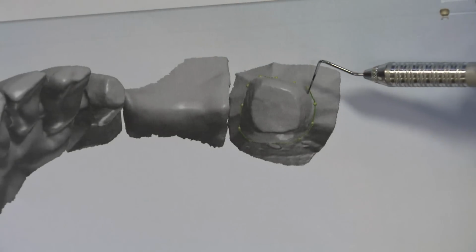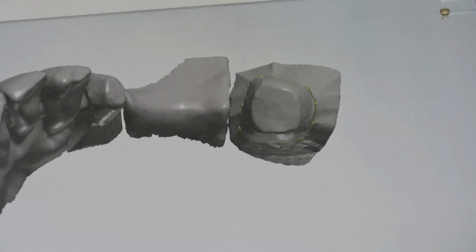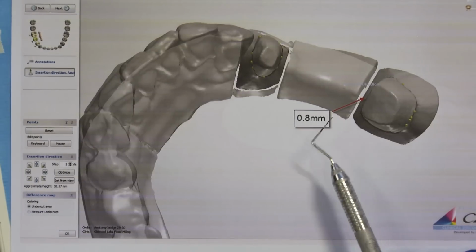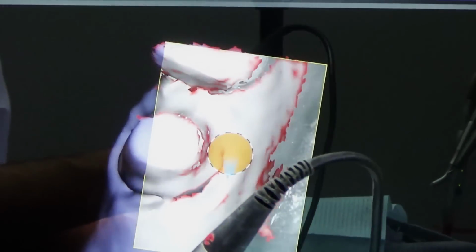When looking at this preparation individually, the preparations are somewhat tapered and we can visualize the margins. But this is a dual abutment fixed prosthesis and the prepared teeth should have parallel axes in order to produce a common path of insertion. Here, the digital design software showed the technician exactly where the undercut is, accurately indicating the amount needed to be reduced.